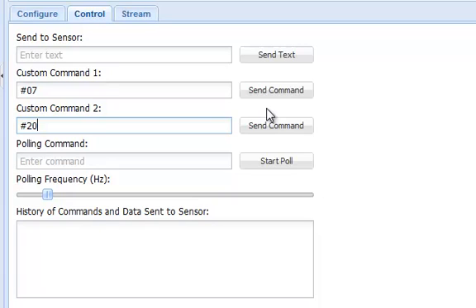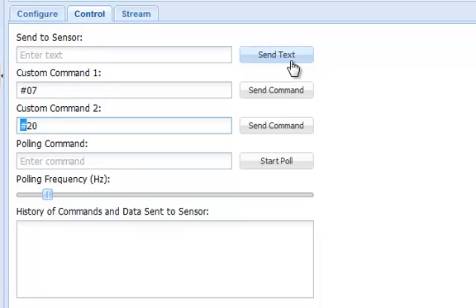I must precede the commands with a hash symbol to tell the control panel to interpret them as hexadecimal character pairs to ensure that they are sent to the Shimmer in binary form. Now, I'm going to start streaming data from the Shimmer by clicking the newly configured Start button.